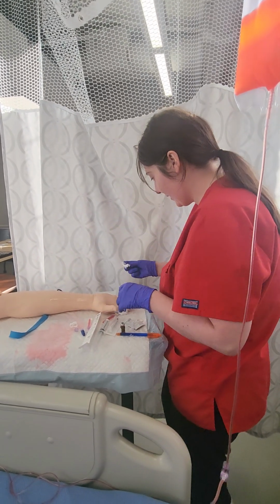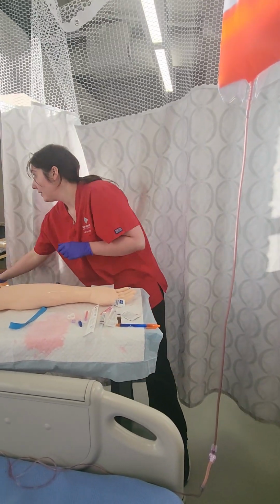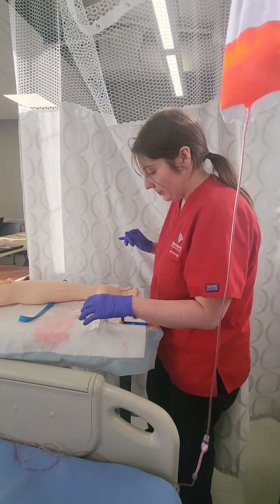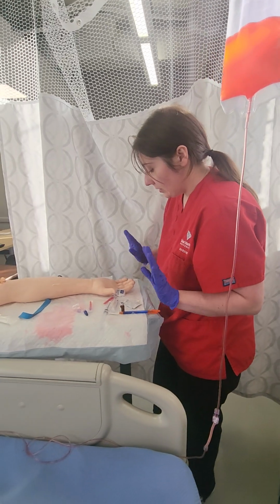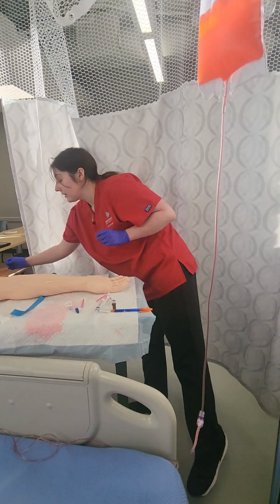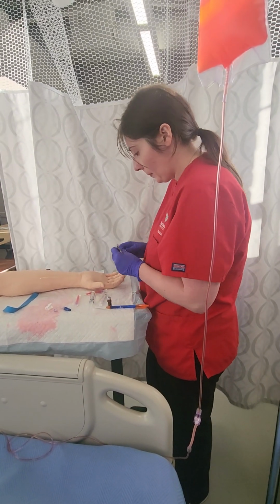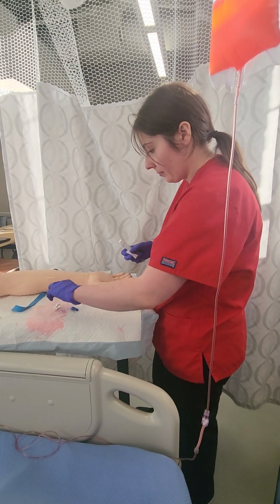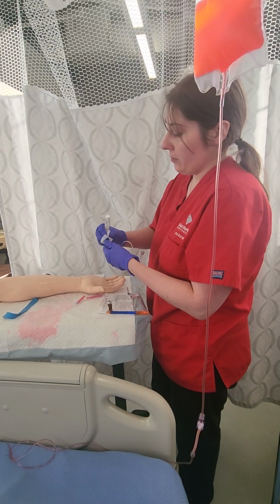Okay, so we're good there. Okay, and now I'm gonna let you dry there, Scott. So we're gonna get set on setting up the rest of my stuff here. So I got the saline here. So I'm going to scrub this.